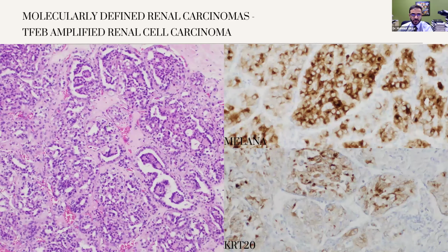You can diagnose TFE3 RCC in the context of morphology, of course. Some other tumors tend to have diffuse TFE3 expression, such as high-grade renal cell carcinomas. GPNMB is a stain for mTOR pathway mutations, and there is a close association between TFE3 and TFEB pathway and mTOR mutations. That's why most of the time GPNMB will be positive, diffusely positive in tumors with TFE3 rearrangement.